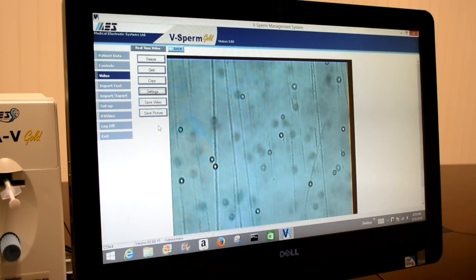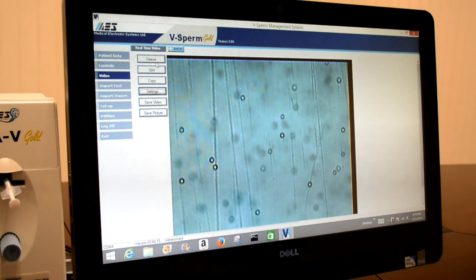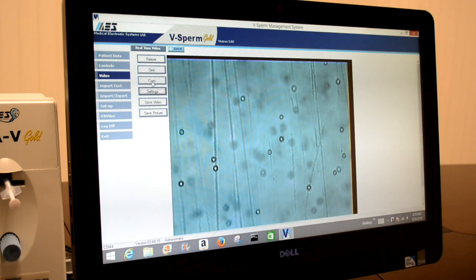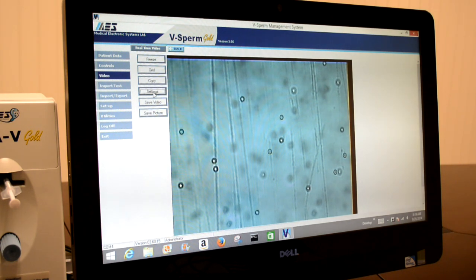You also have the ability to freeze the image, activate a counting grid, copy a still image of the sample, and adjust settings as necessary, such as brightness, contrast, color, and sharpness.